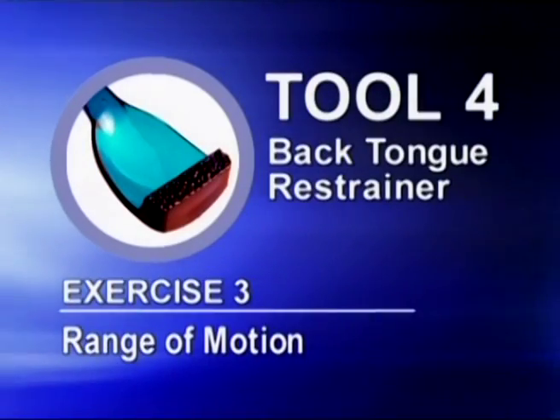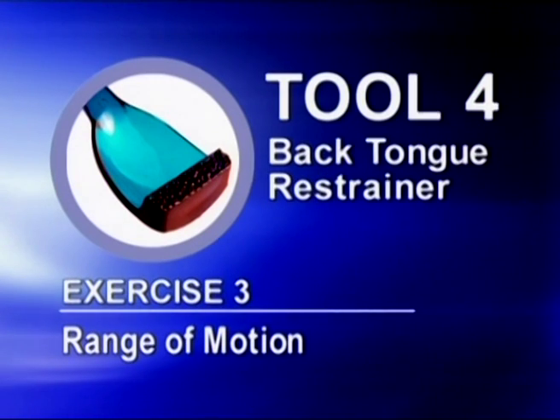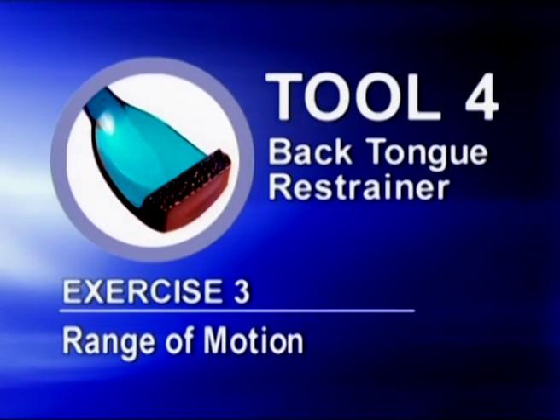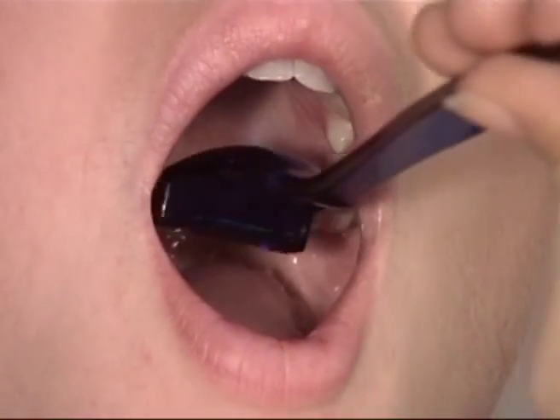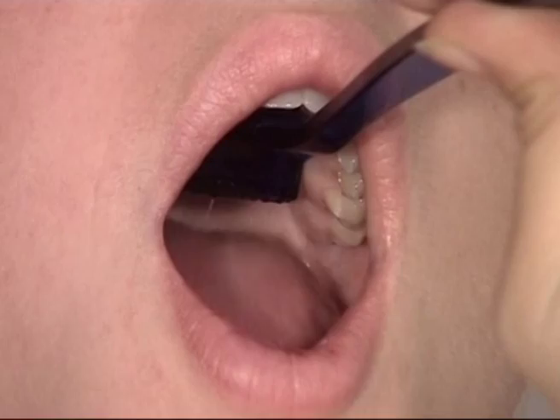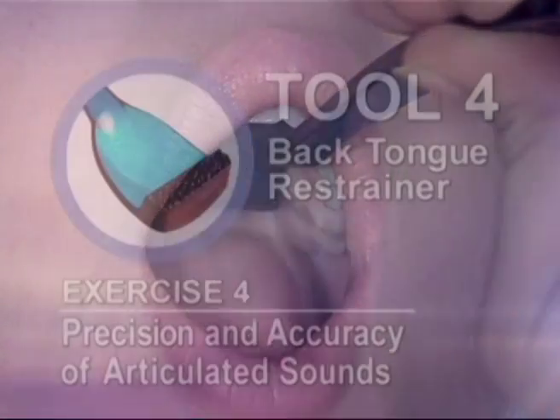The goal of exercise protocol 3 is to increase range and ease of motion for the back of the tongue to extend to the back of the hard palate. Place tool number 4 on the palate behind the front teeth. Elevate and lower the back of the tongue against the ridge of tool number 4. Repeat as many times as possible. Record number of elevations until fatigue.